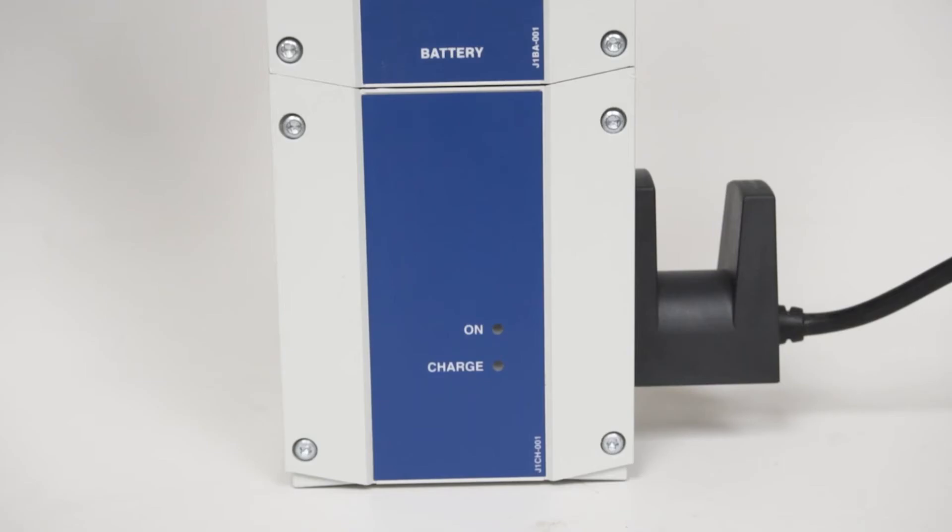Two lights will illuminate on the control box. A green on light, which indicates the charger is plugged into the wall, and a yellow charge light, which indicates the system is charging.